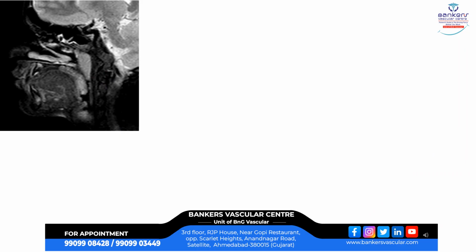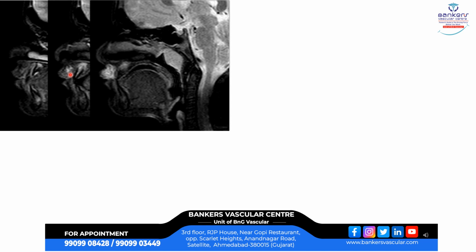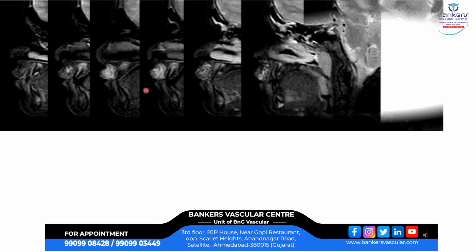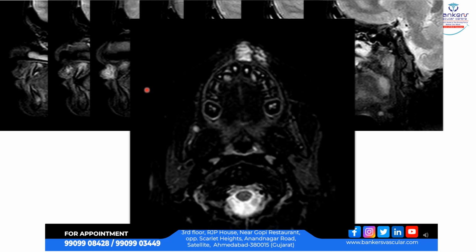So this is a classical case of slow flow venous malformation in the lip region. This is the MRI. The upper lip region right now is absolutely normal, but from this slice a small lesion has started. Gradually the entire upper lip is involved up to the midline, and these are the lesions involving the upper lip portion. In the axial section we have a better view that the entire upper lip is involved and it is extending on the left side.